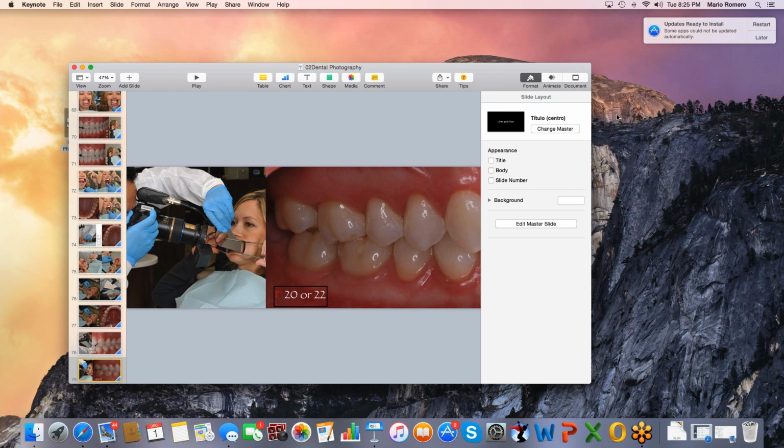So, at the end of the day, like I said, you can use either metal or glass. I think that if you're getting a double image, it's because of the quality of the glass.